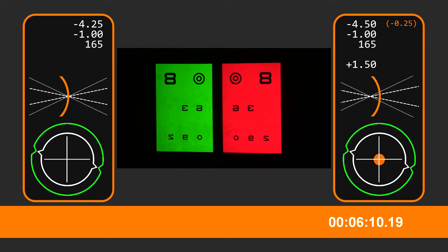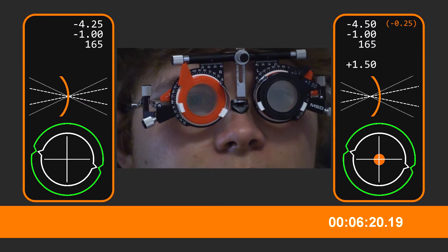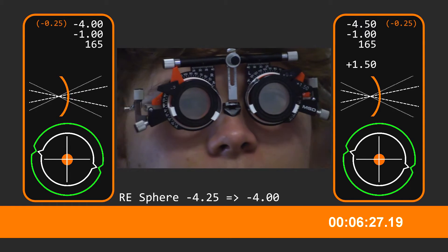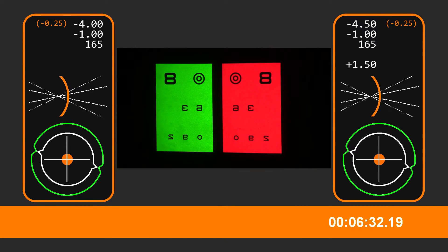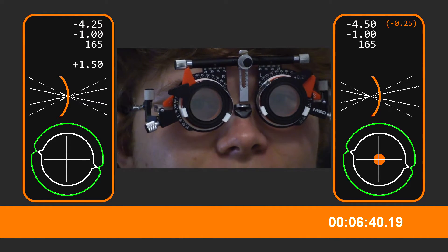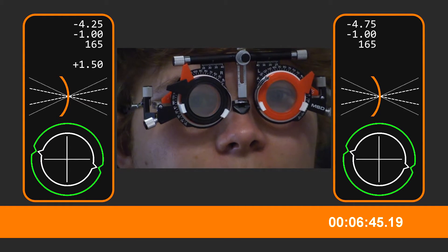I think it needs to be a little bit darker so I can't really see the red. It doesn't work in this room, does it? Which one's clearest? Go with green. Go with reds. Evenish, yeah. What about red? Red. And now? About the same.